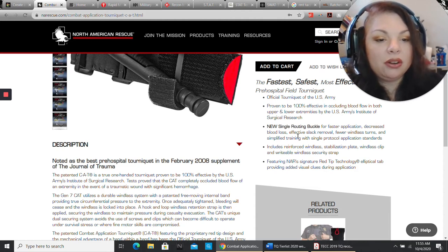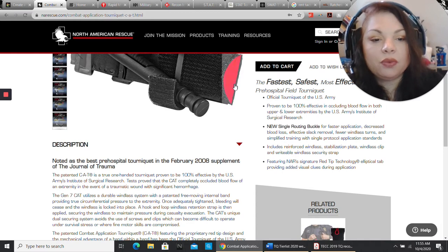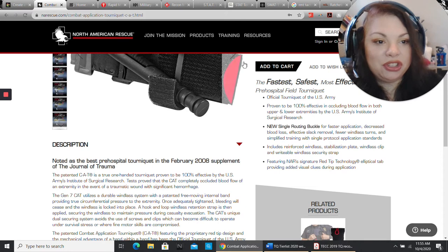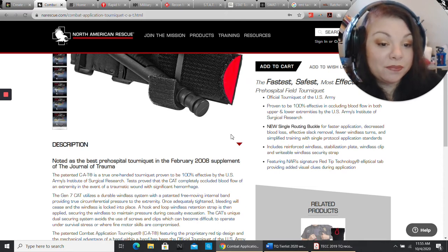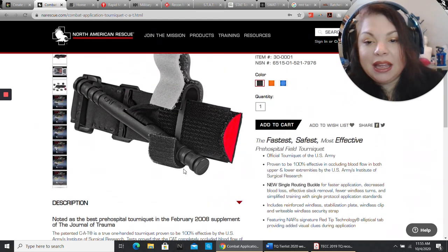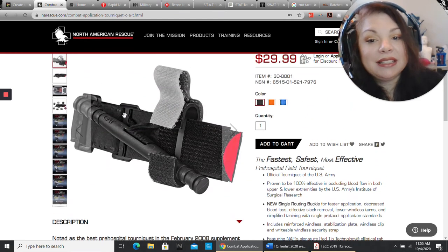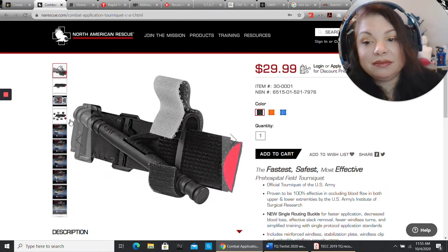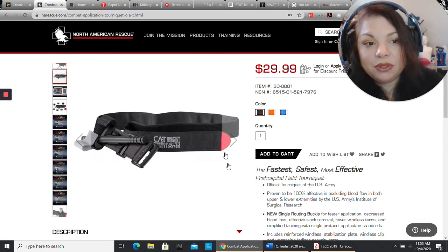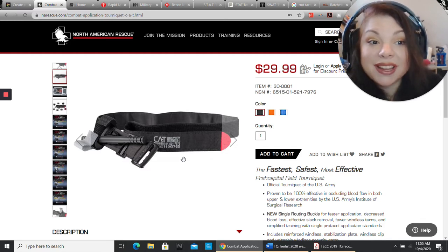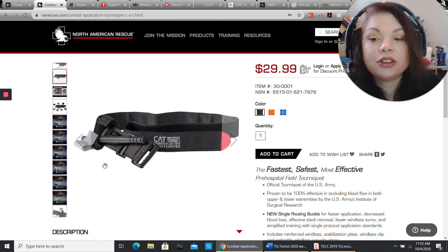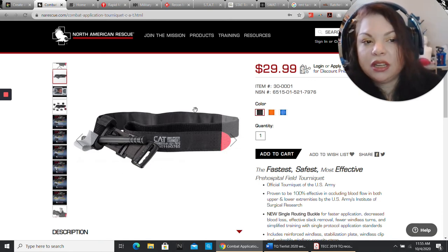Single routing buckle. The red tip technology is the tab that actually allows you to see it, which is a good thing. It's great. It's classic for a reason. You'll know it's an actual cat because it will say on here, CAT tourniquet. If you buy a tourniquet and it has a picture of a kitty cat, that's not actually a CAT.